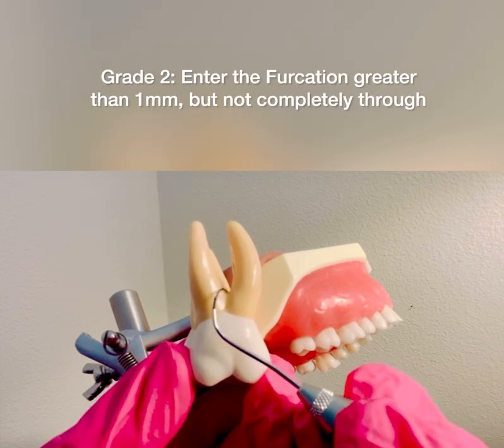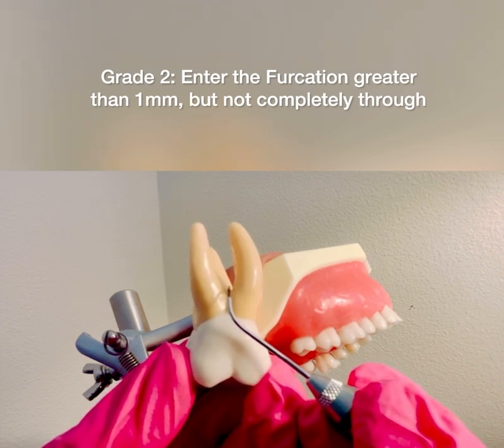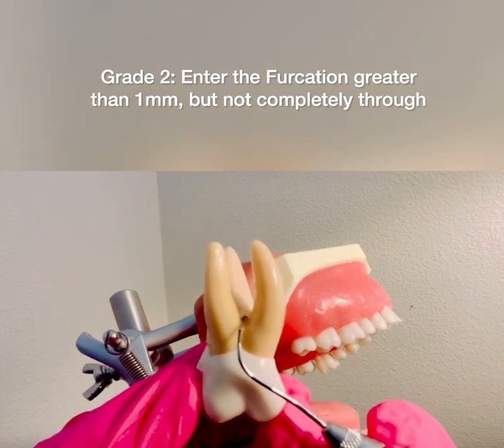If I continue and feel greater than one millimeter and I can go about a third of the way but not passing through the furcation — not hitting the palatal root — that is a grade two.